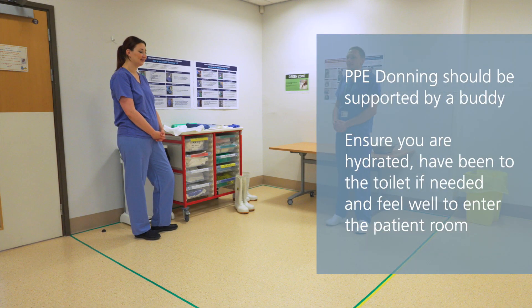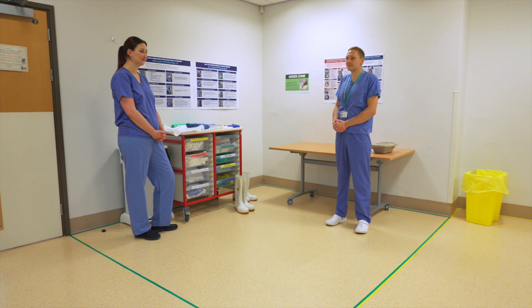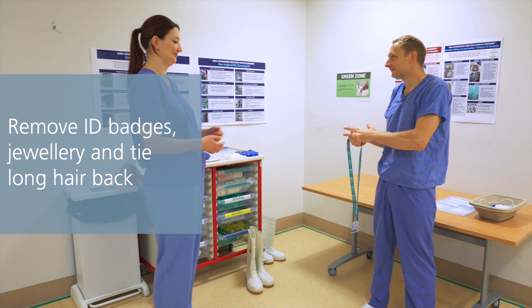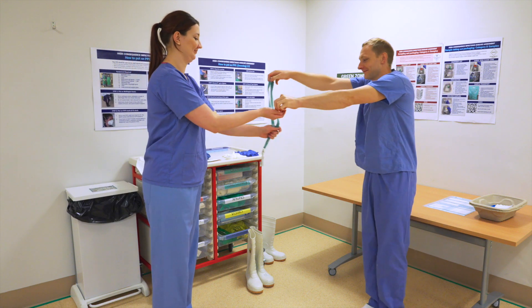PPE donning should be supported by a buddy who checks the fit and integrity of the PPE. Before donning PPE, ensure you are hydrated, have been to the toilet if needed, and feel well enough to enter the patient room. Remove ID badges, jewellery, and tie long hair back. Wash hands and cover any cuts with a waterproof dressing.